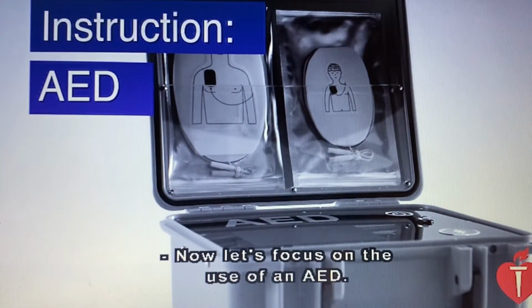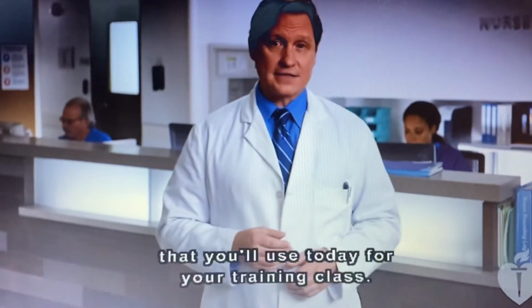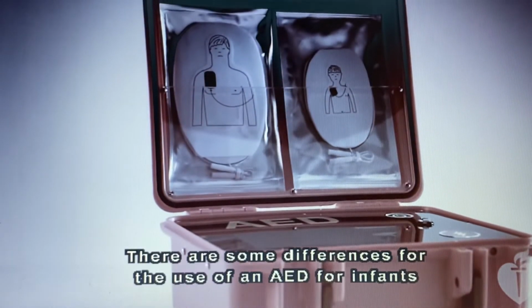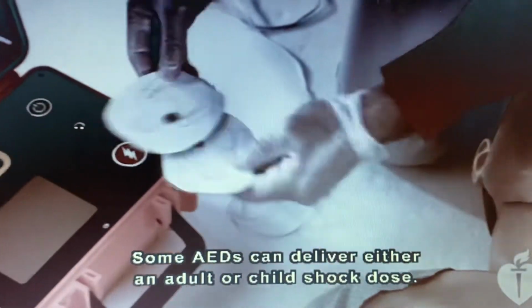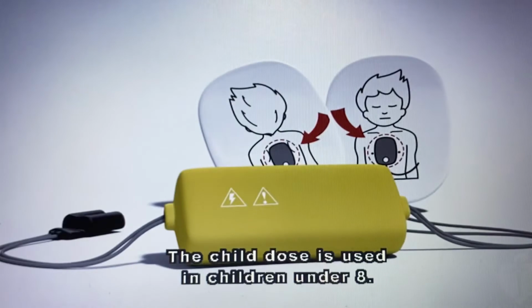Now let's focus on the use of an AED. You'll be familiarizing yourself with the AED device that you'll use today for your training class. There are some differences for the use of an AED for infants and children under 8. Some AEDs can deliver either an adult or child shock dose. The child dose is used in children under 8.